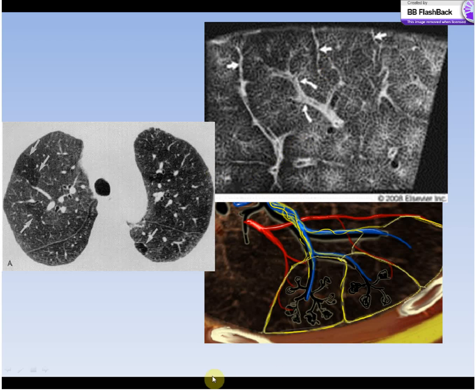Again, the diagram. So keep this picture in your mind, because as we move forward, this is how we're going to describe those 4 pathologies outlined earlier, those 4 patterns.